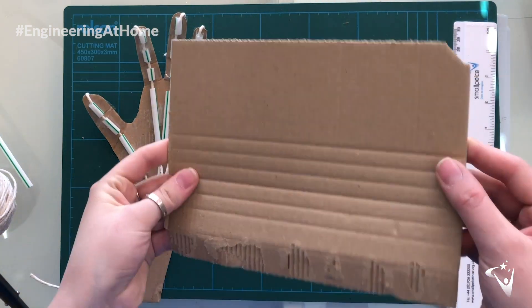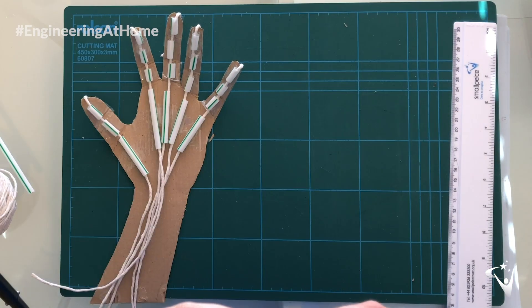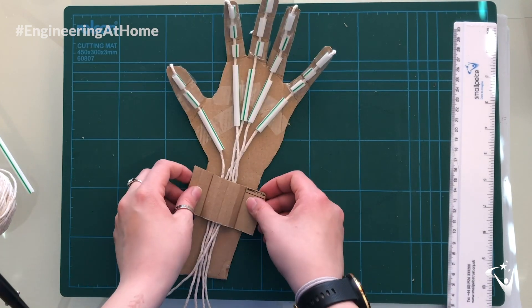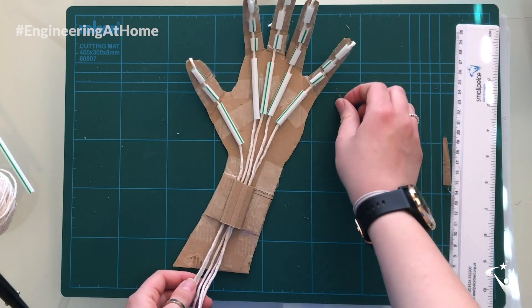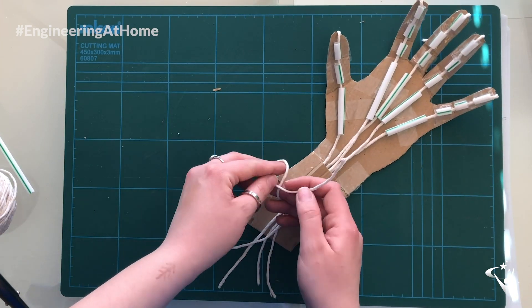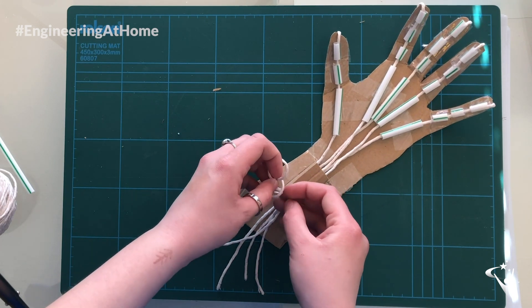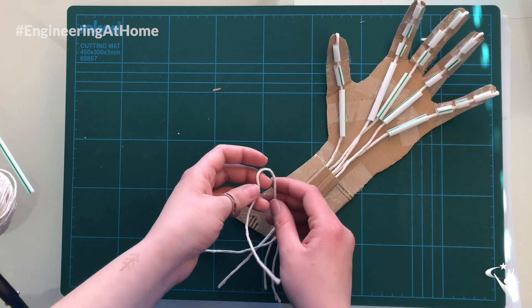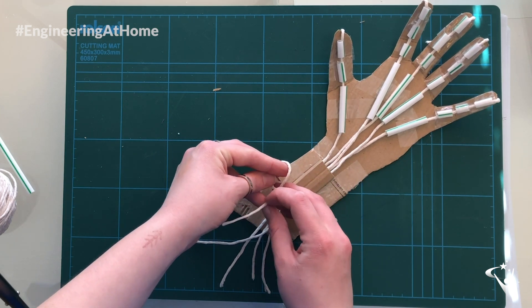Once you thread all five strings through the fingers, you're then going to need to gather them at the bottom at the wrist. To do this, you want to make a bridge out of cardboard and stick this down on the wrist of your cardboard hand. The final thing we need to do is tie a loop in each of the pieces of string for each finger — that way you're going to be able to control your prosthetic hand. To make the loop, follow the video very carefully — you can rewind and watch it again if you need to.